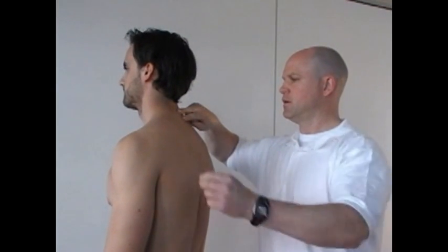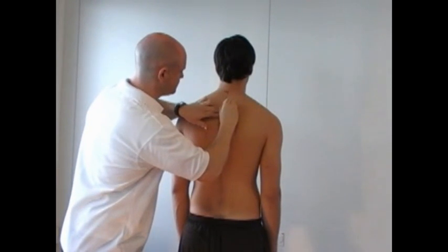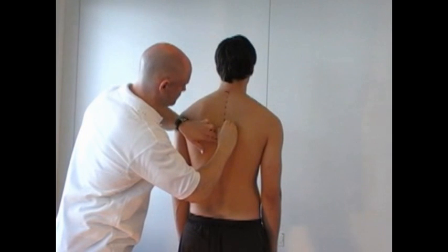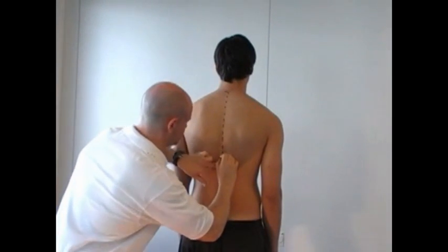Use a marker to mark the center of the spinous process of C7. In some people, the course of the spinous processes along the center of the spine is not easily visible over its whole length. In such cases, at least some of the spinous processes should be palpated and marked regionally.